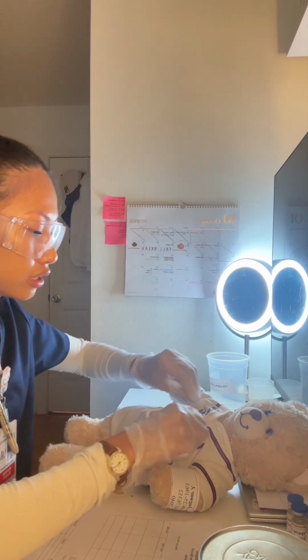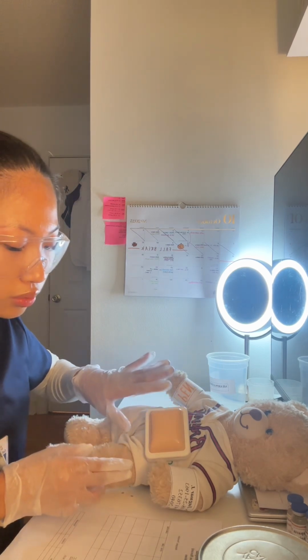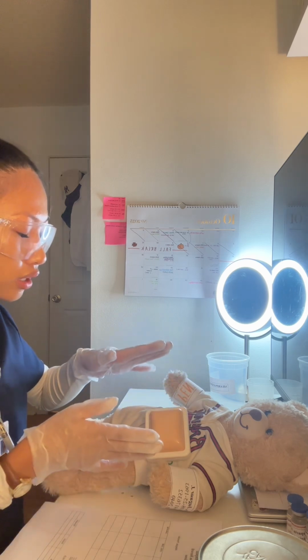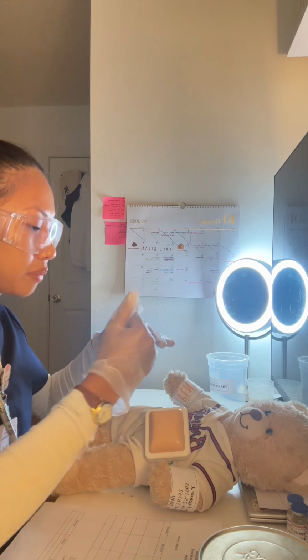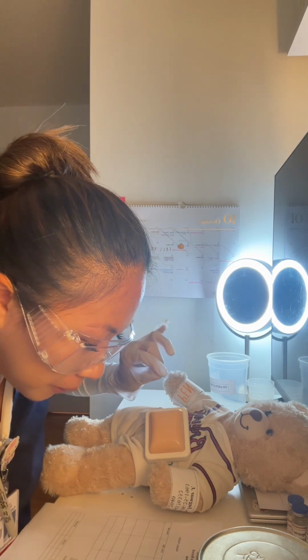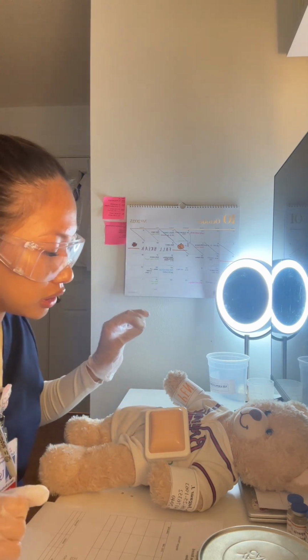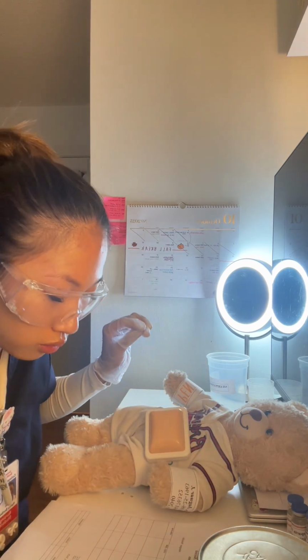So I'm gonna go ahead and open his gown, and then I will give this 1.5 to 2 inches away from the umbilical, and then I will also avoid going past your anterior superior iliac spine, and then I'll also avoid going past your costal margins and below your pubis, leaving me with a U shape. Right, and then I will be giving this 30 minutes before your meals. I'm gonna go ahead and check. Yep, you haven't had your insulin shot yet, and you would need this in order to have your meal, just so your blood glucose level is not rocketing.